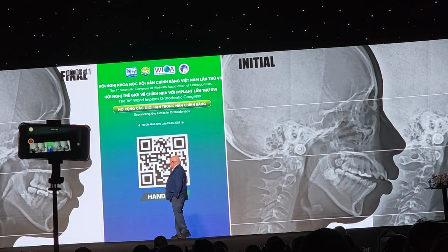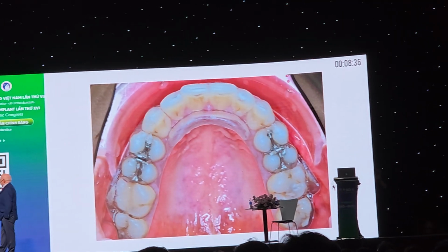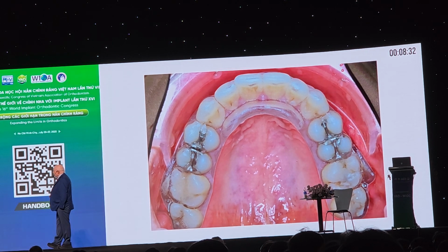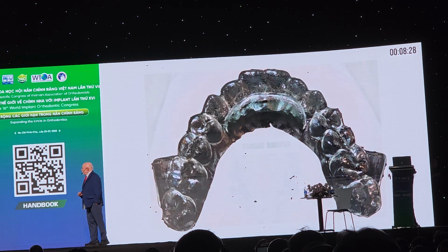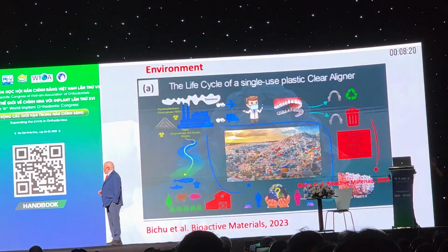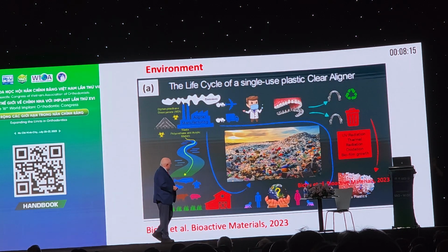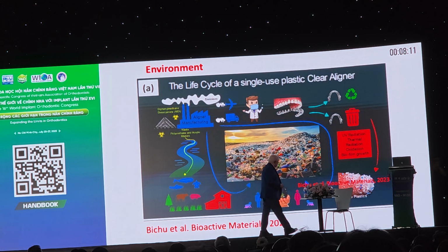You can see open bite cases. You can make these attachments, this kind of bumpers with the aligners, tongue bumper. So you can do all sorts of appliances. I just put some of these together, just to show you what your software can do for you. My end is coming.